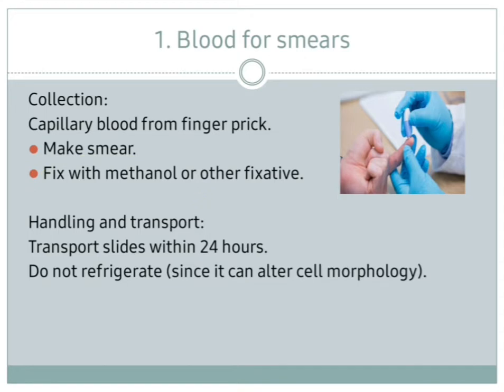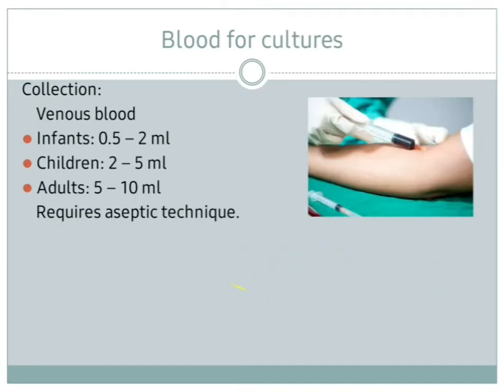Handling and transport. The transport slides within 24 hours. مثل ما ذكرنا أن الترانسبورت يجب أن يكون rapid and do not refrigerate because refrigeration will alter the cell morphology. So you have not to refrigerate it. This is about the blood for smears.